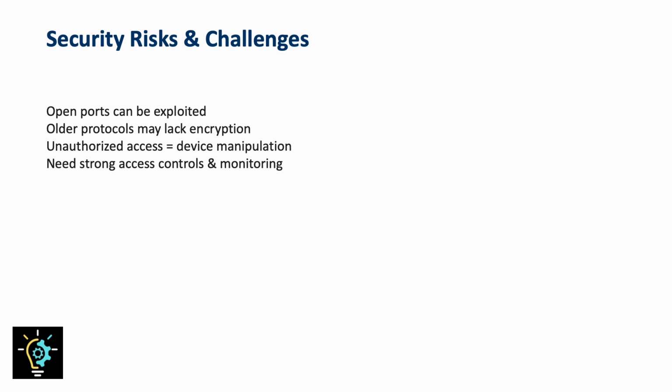With so many connected devices, security becomes a major challenge. Open ports can be exploited by attackers if not properly secured. Protocols that lack encryption, like older versions of HL7, may expose patient data. Unauthorized access to a device could allow tampering with critical functions.